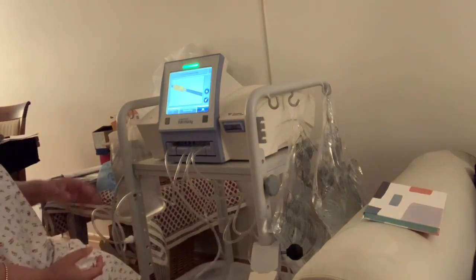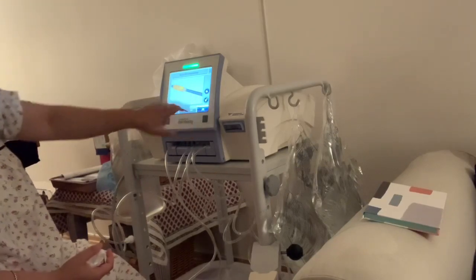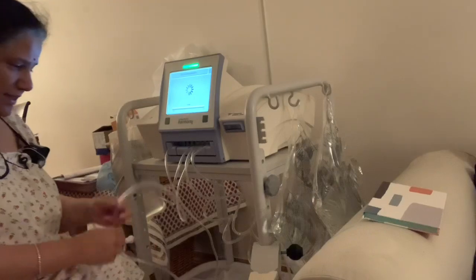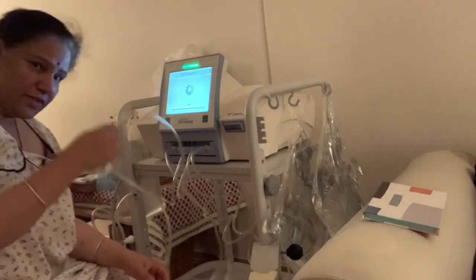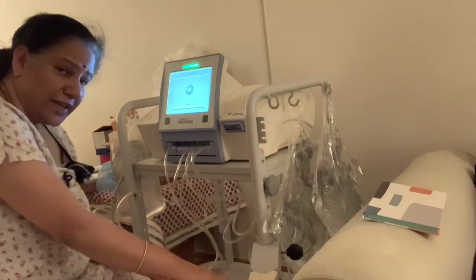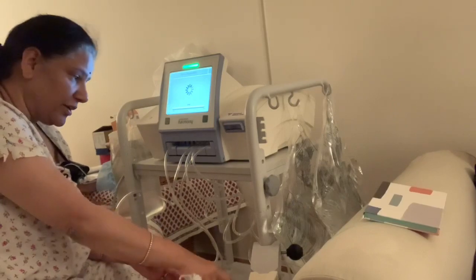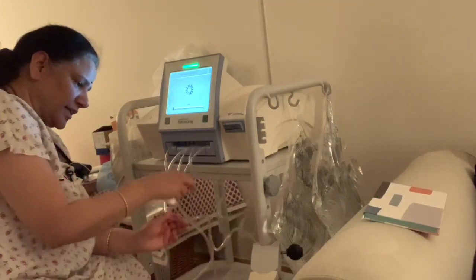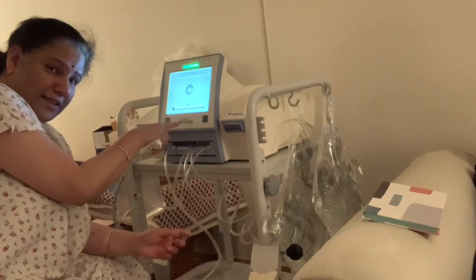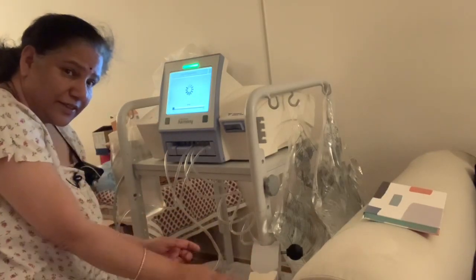Now we press the button again, and all these wires are filled up with fluid — because there should be no air going into the body, just like in the manual one. We wait until all the wires are filled up; that's a six-minute process.